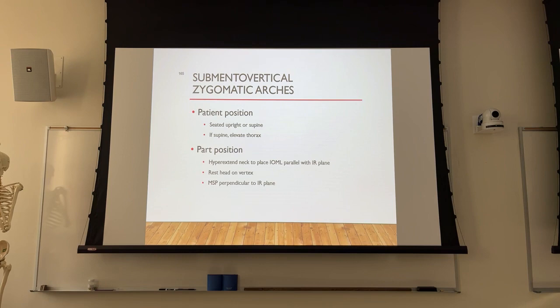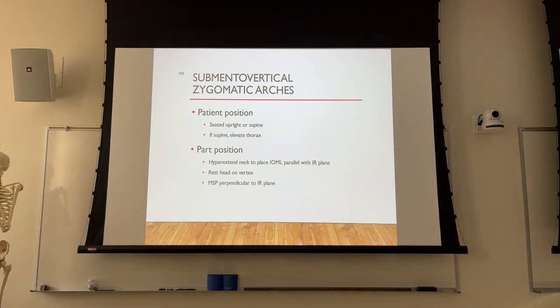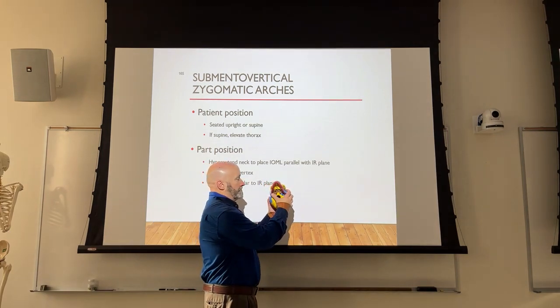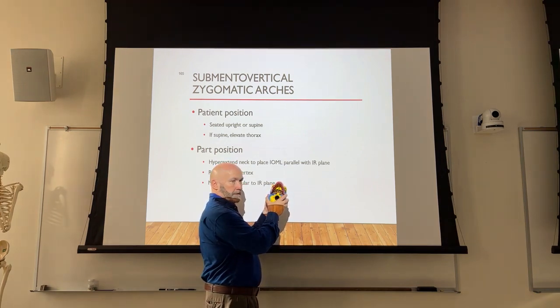Sounds kind of contradictory, doesn't it? But it's not. What it's talking about is this. All right, so step one was, in those two things, rotate the mid-sagittal plane of the head approximately 15 degrees towards the side being examined, right? So what it's saying is if we're looking for the left zygomatic arch, we're gonna rotate towards the side being examined, all right? Do you see it?